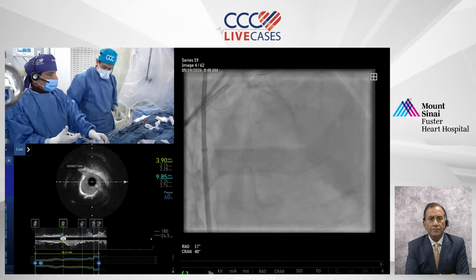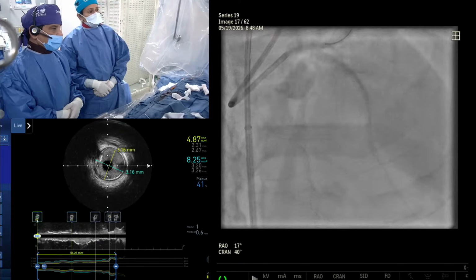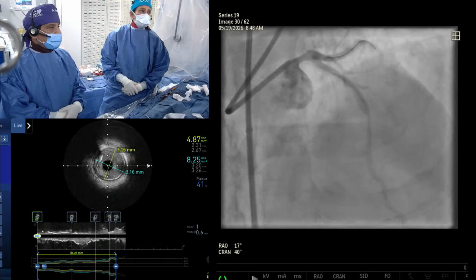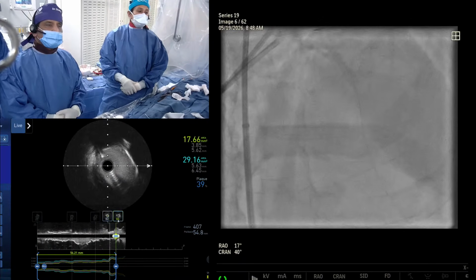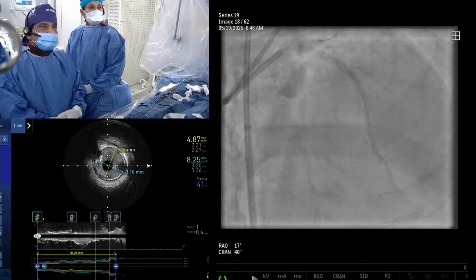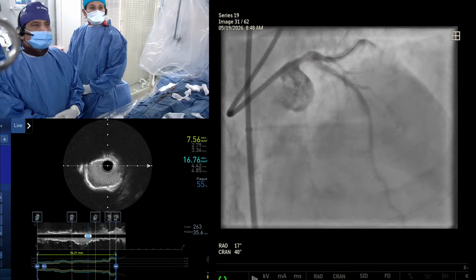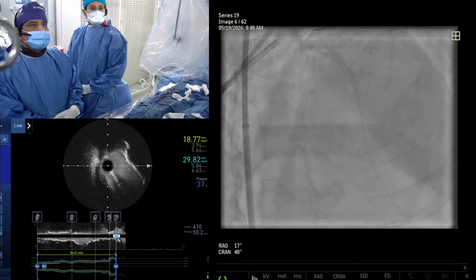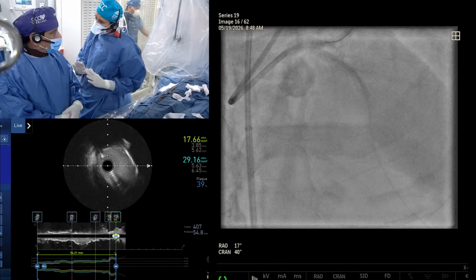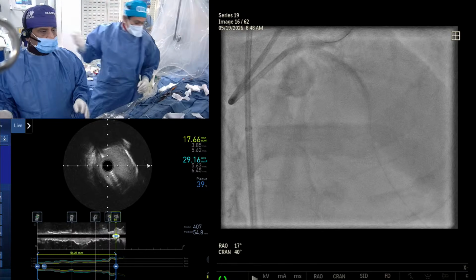Go to Cordon. No, this is okay. No, we can go here itself, right? 3.0, let's go 3.0, and then you have to go up to there. Okay, 3.0 or 4.0. The left main is what? Can I go 3.0 and then post dilate the left main to 4.0? Yeah, start with the pullback. The mid LAD is 3.1 vessel, the proximal LAD is like a 3.9 vessel, and the left main is more than 4 vessel. It's a huge size gap. So you want to go low pressure 3.5 or 3.0 and high pressure? I would go 3.0. Okay, yeah, please. That's okay. Give us a 3.0 or 4.0. Nothing wrong in that. I remember that. I go with the eyes.